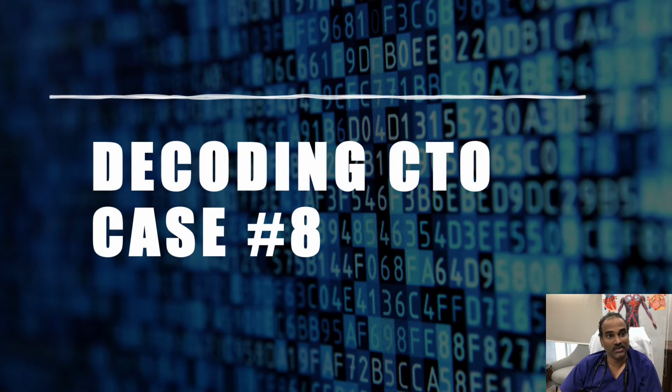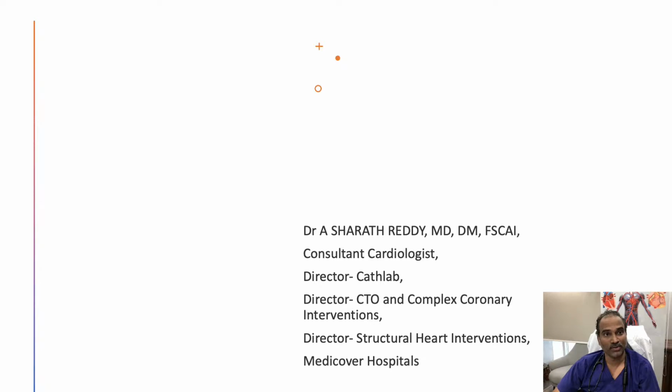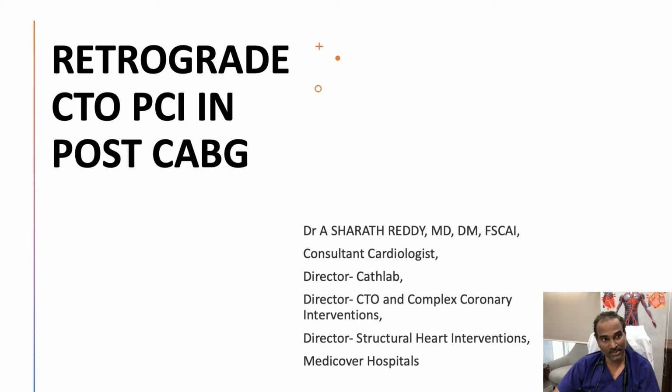So welcome to Decoding CTO PCI, Case 8. I am Dr. Sharath, Interventional Cardiologist, Medicover Hospital, Hyderabad. So today's case is CTO PCI in a post-CABG patient through retrograde via posterior AV groove collateral.